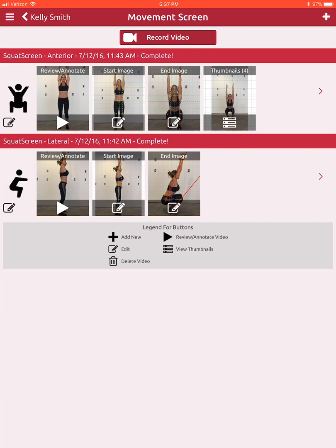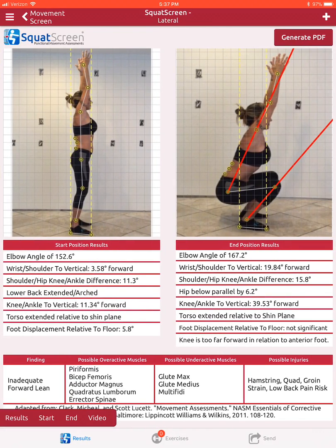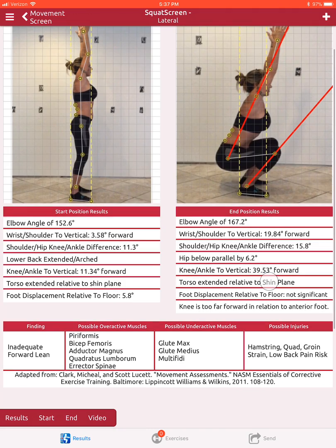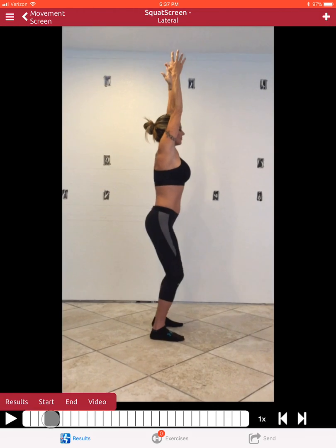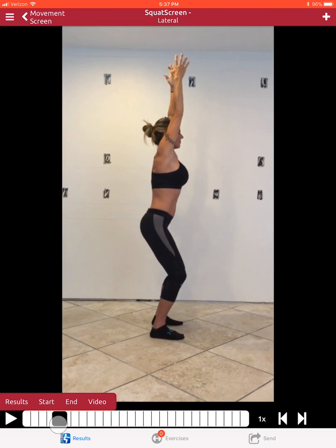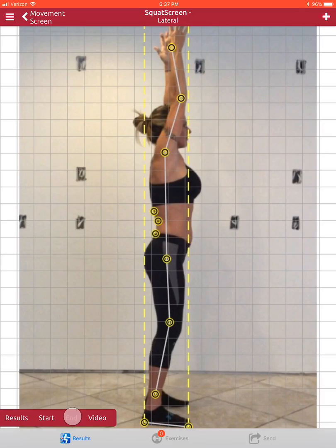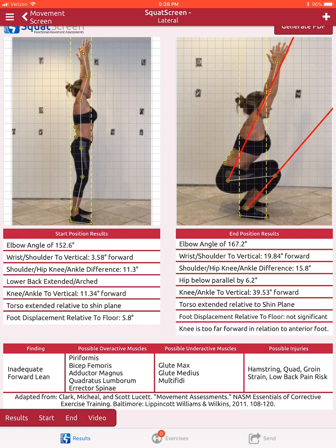In other videos we demonstrate how to do the assessments, but with the movement assessment on the overhead lateral squat it identifies the possible overactive and underactive muscle groups. You can scrub through and show the clients their start and end positions as well as the video, and here is what saves a practitioner a lot of time.